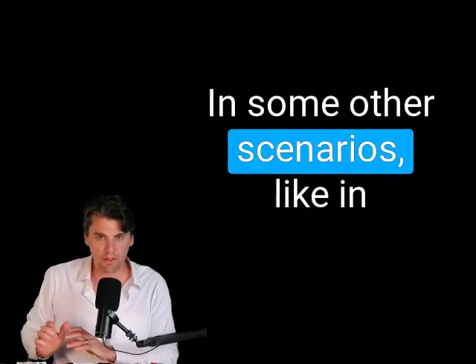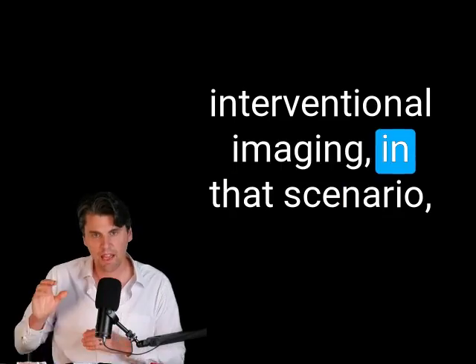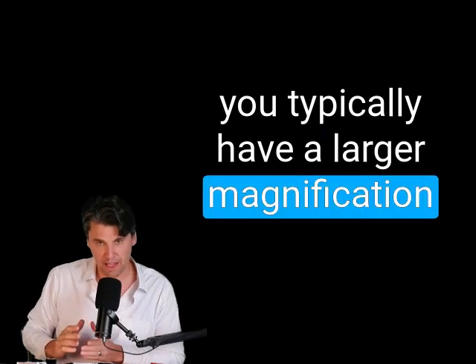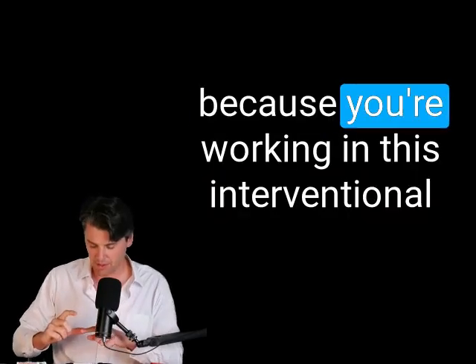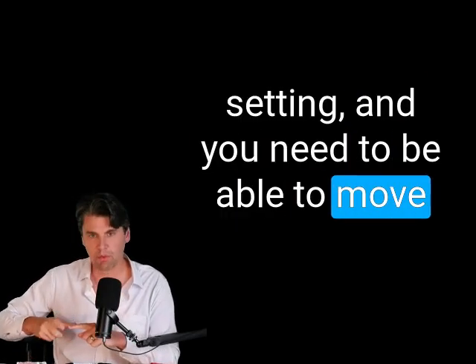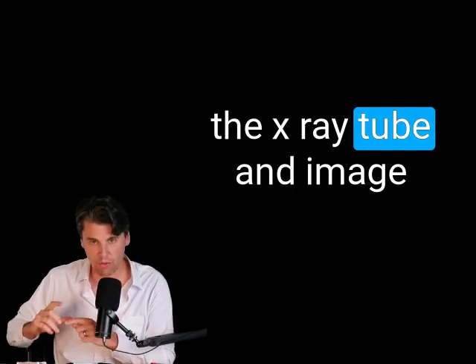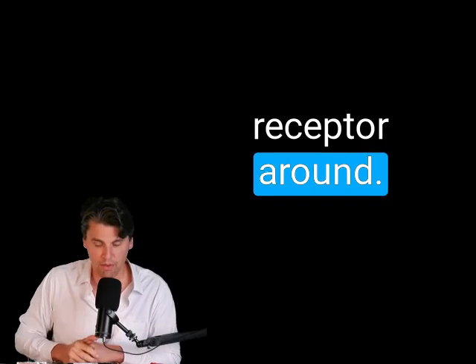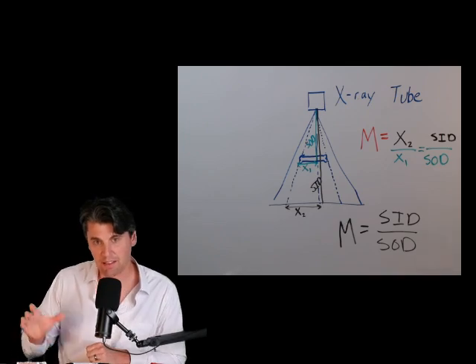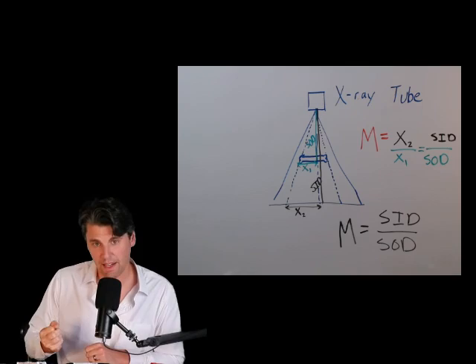In some other scenarios, like in interventional imaging, you typically have a larger magnification because you're working in this interventional setting and you need to be able to move and rotate the X-ray tube and image receptor around. You typically have a geometry where the magnification is larger in that interventional setting compared with your standard radiography.